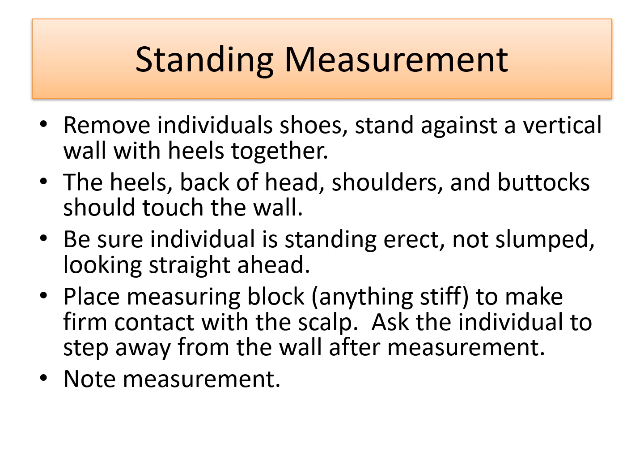Standing measurement. Remove the individual's shoes, and have them stand against a vertical wall with heels together. The heels, back of the head, shoulder, and buttocks should touch the wall. Be sure the individual is standing erect, not slumped, looking straight ahead. Place a measuring block, anything stiff, to make firm contact with the scalp. Ask the individual to stand away from the wall after measurement and note the measurement.